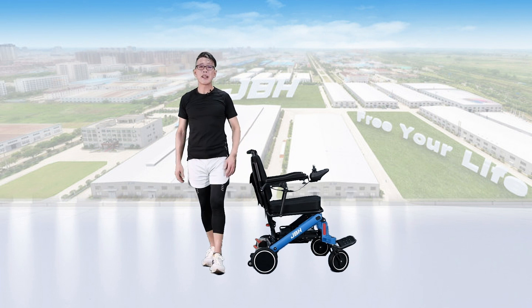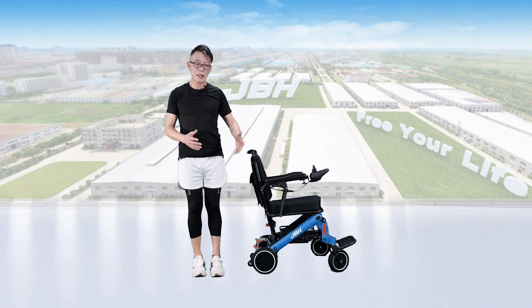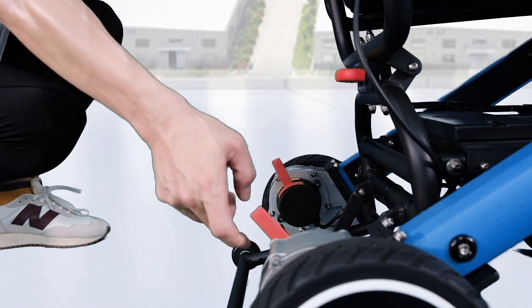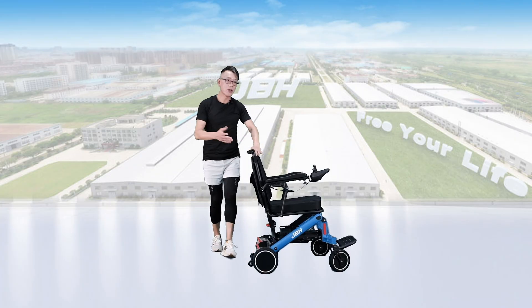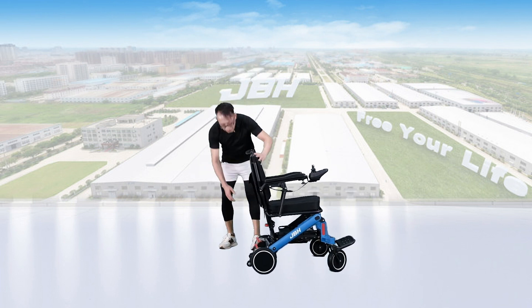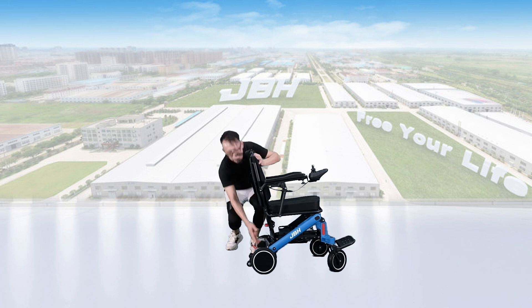The wheelchair has a free wheel mode design that allows you to switch between manual or electric control. Simply push the two levers on the back to the front — that allows you to control through your hands. If you want electric mode, just push the two levers back.